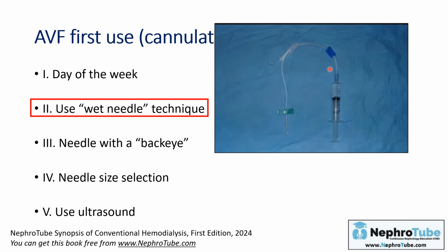The syringe must flush and aspirate with ease. And while you are doing this, monitor for any signs or symptoms of infiltration.